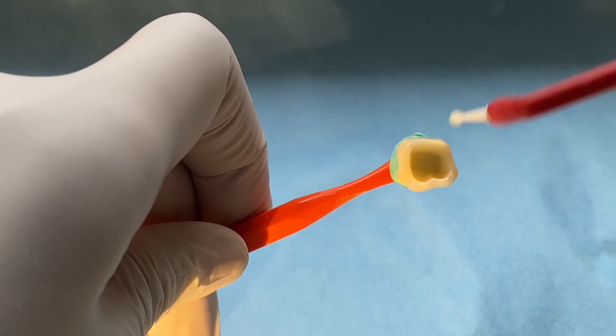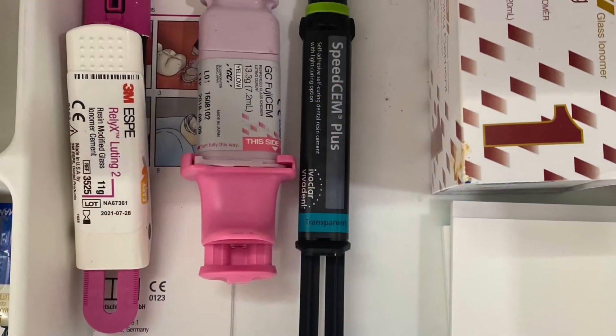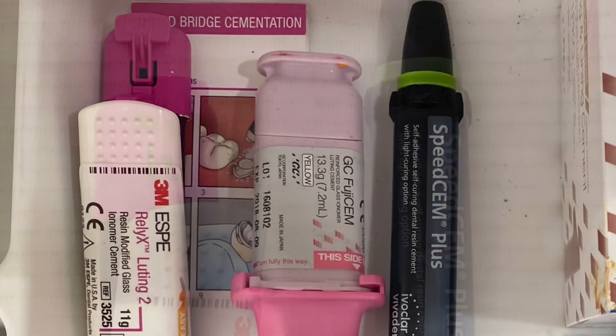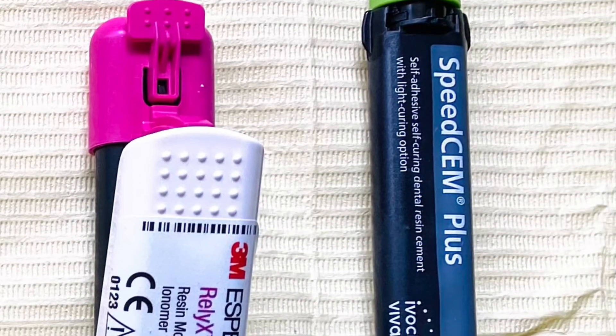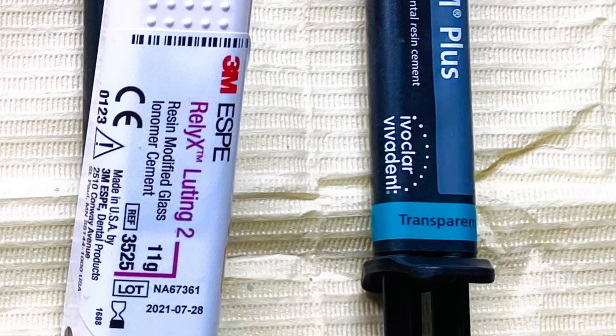If you don't have zirconia primer, alternatively you can use a universal bonding agent containing MDP. You can choose your cement of preference. I usually recommend resin-modified GIC if your margins are sub-gingival, and resin cement if your margins are supra-gingival or equi-gingival.